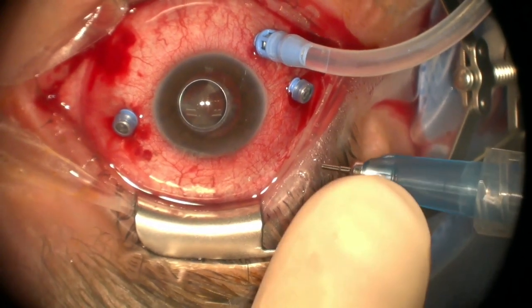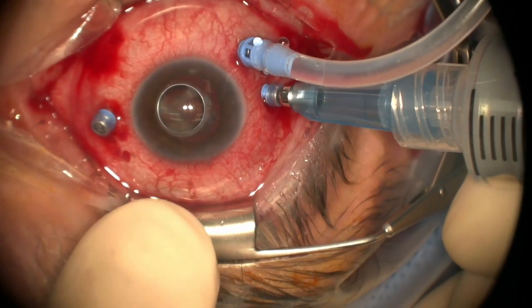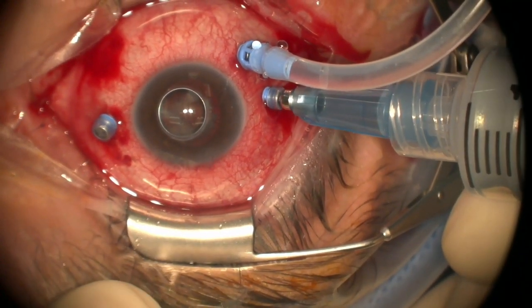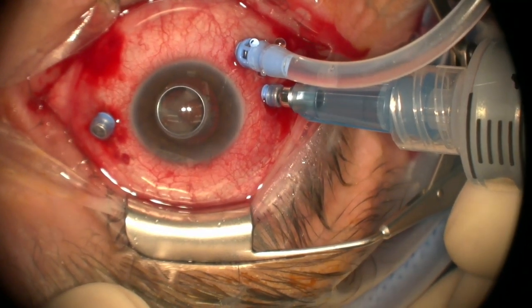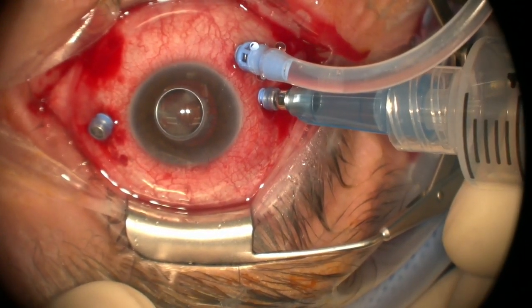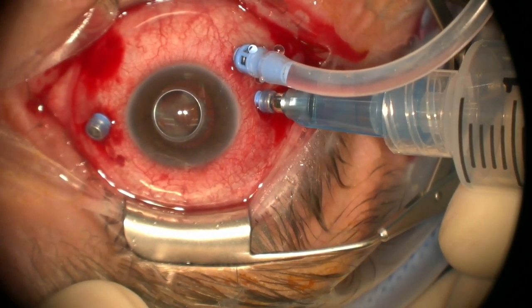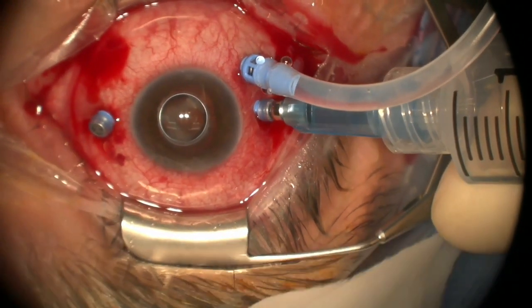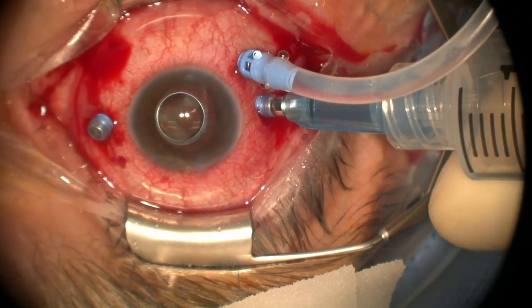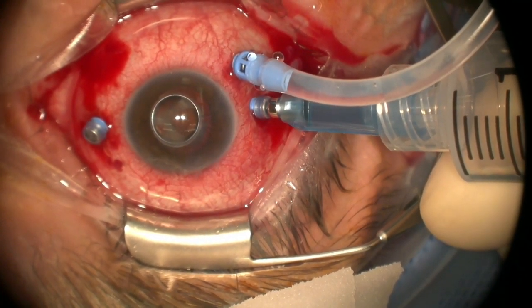We have a 25 gauge setup. And we're going to see how this oil is coming out and whether it's going to come out fast enough on oil extraction. So we're going to see how quick that oil is coming. Oh, it's not bad. I think it's 1,000 just because of the time frame. Yeah, the time frame. Right. Oh, no. The surgery was a few months ago. But 1,000 was back in stock by then.